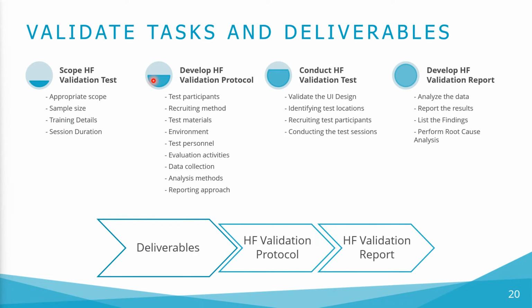The protocol will also list the open-ended questions we will use to collect test participants' subjective impressions of the product's use safety as well as the root causes associated with any use errors, instances of moderator assistance, close calls, or difficulties that occur during the HF validation test.